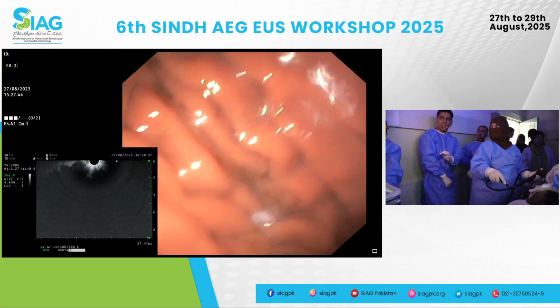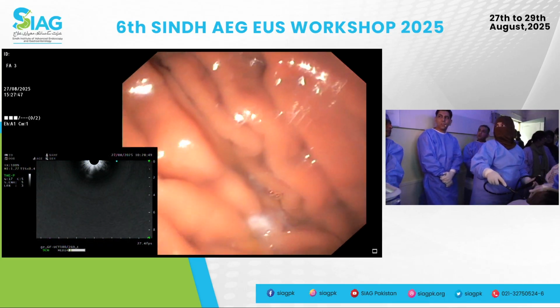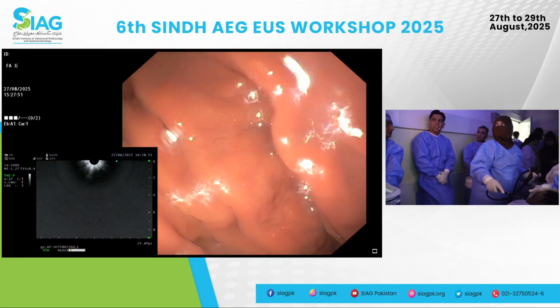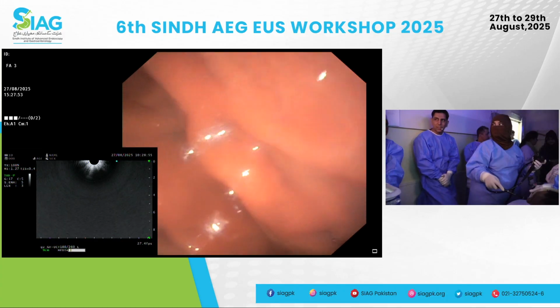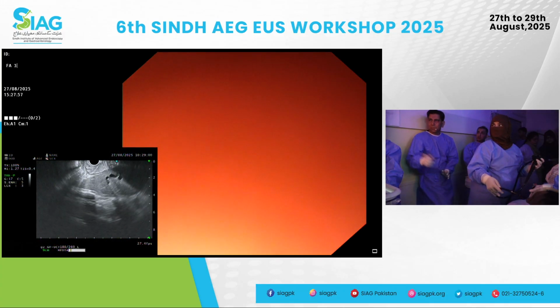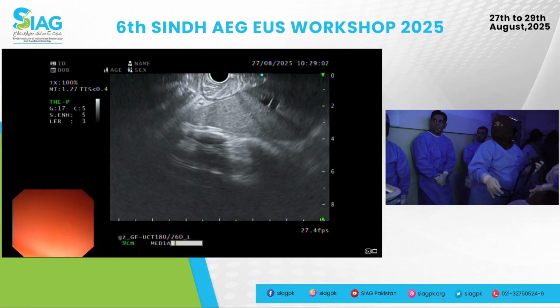Good. So you're doing exactly what Dr. Hassan suggested earlier, advancing the scope to the greater curve. Good. There's no hiatal hernia. Excellent. Keep advancing the scope, please. One minute, wait. Good. Excellent. And now what will you do? Excellent. Good. Now give us the EUS image. Good.